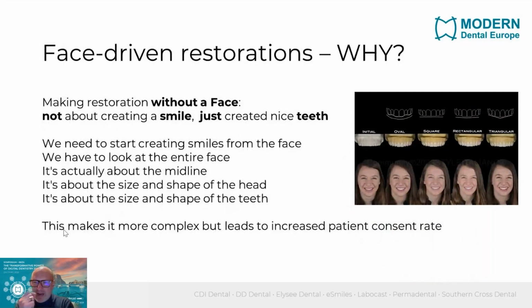So why is this so important, these face-driven restorations? Well, actually, it always starts from the face. We are not creating nice teeth only, we are creating a new smile for full rehabilitation cases, for instance an all-on-X case, or a denture, also just a removable denture. This should always start by creating a smile from the face.